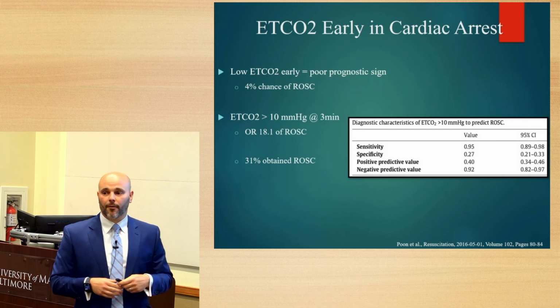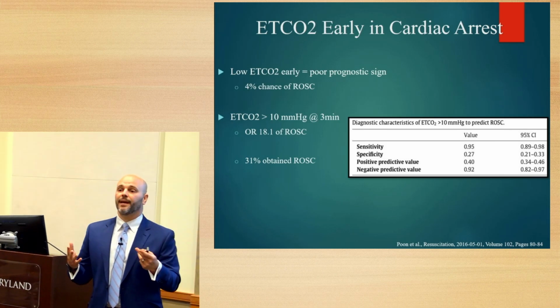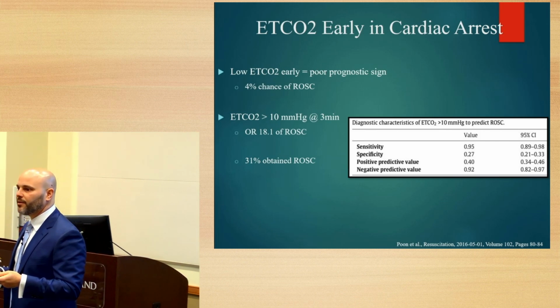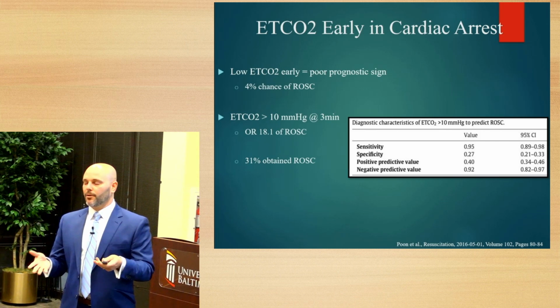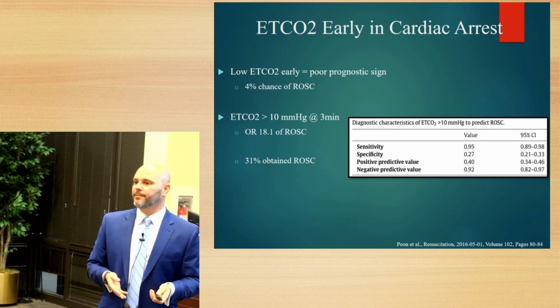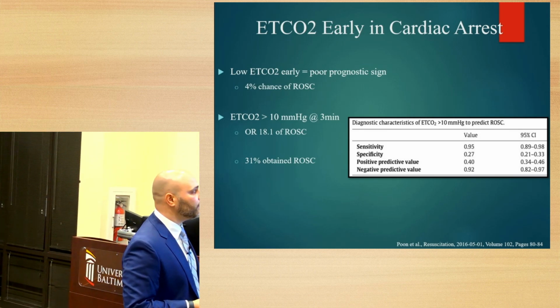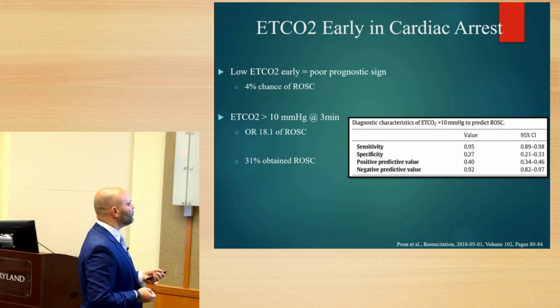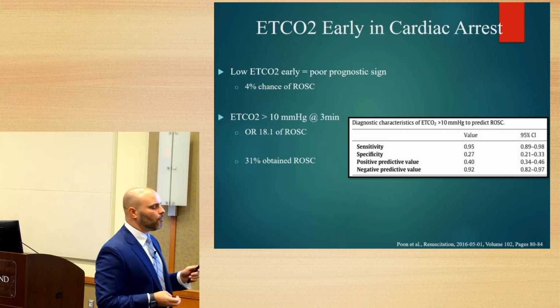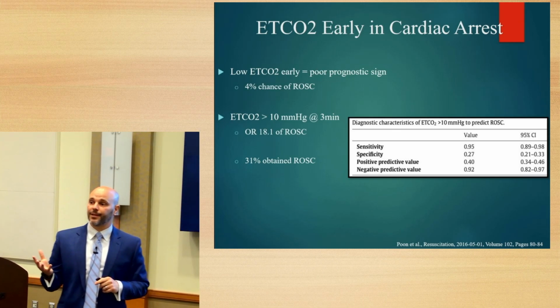Now, early in cardiac arrest, we want that CO2 to be high. If it is not, we are concerned that there's not a perfusing rhythm and potentially cellular respiration is down, right? So we really want to get that up. So this study was about 110 patients who were undergoing cardiac arrest and had an end-tidal CO2 taken.